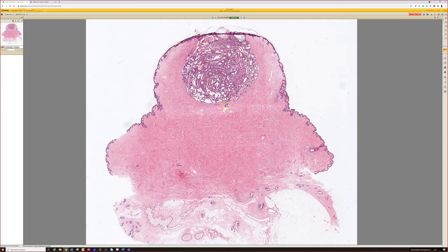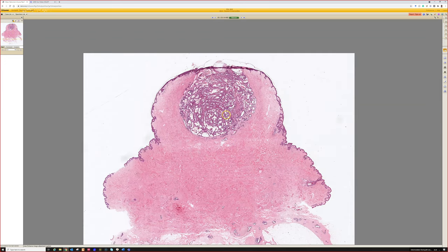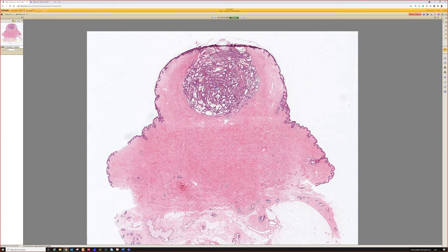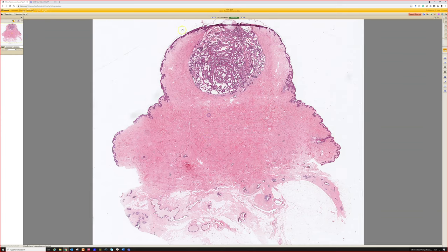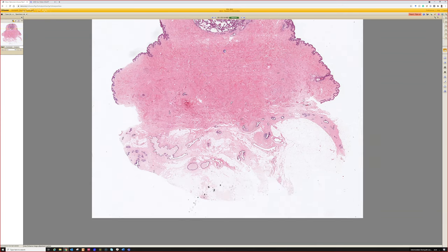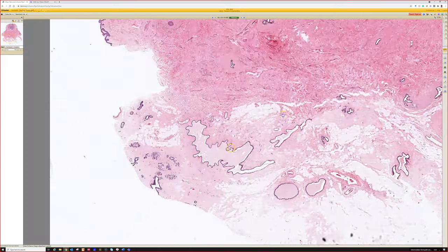Yeah, very good. This is erosive adenomatosis of the nipple or nipple adenoma, same thing. And this is great because I don't know if I've ever seen such a perfect sized example. It looks like, unfortunately, the whole nipple was removed, but I wonder if maybe this was an incidental finding like in a breast cancer. I don't know anything about the history of this case, but usually I get a small biopsy and I can't see the base. So we can tell we're on the nipple though here because look what we have down here.